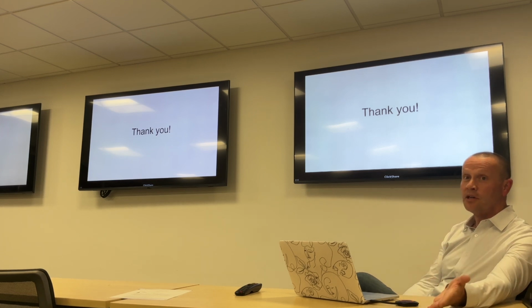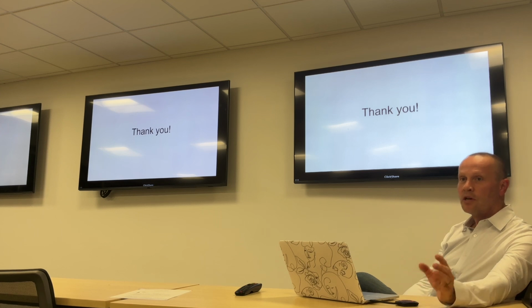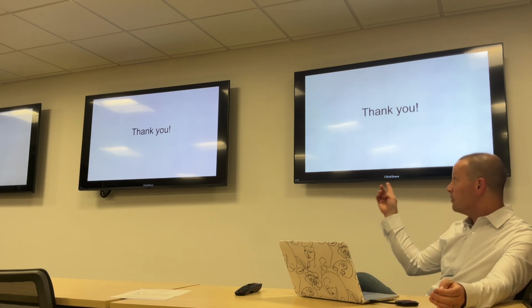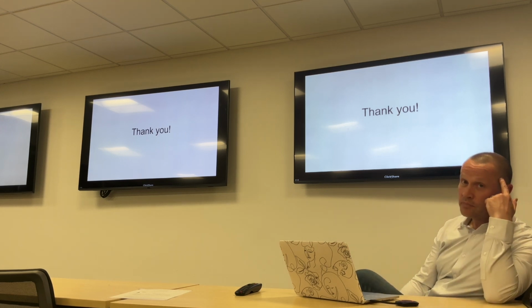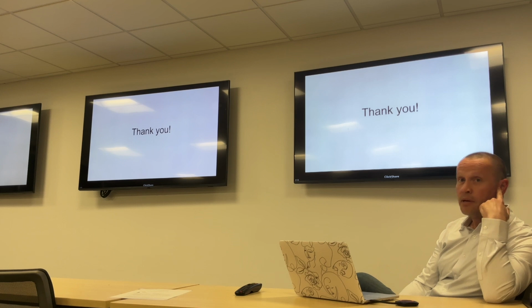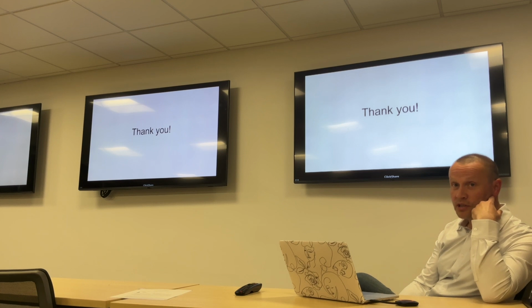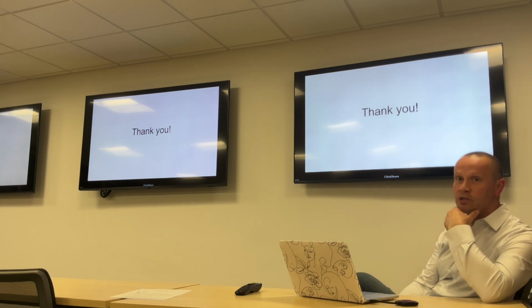So if you want to see something in the bones, if you want to see a fracture, that's a CT. MRI can do okay at that, but not that great. Soft tissue, similarly, if I was trying to read somebody's brain and see if their brain has MS in it, and I was only given a CT scan, I could potentially see some of the lesions, but with much less sensitivity and much less precision.